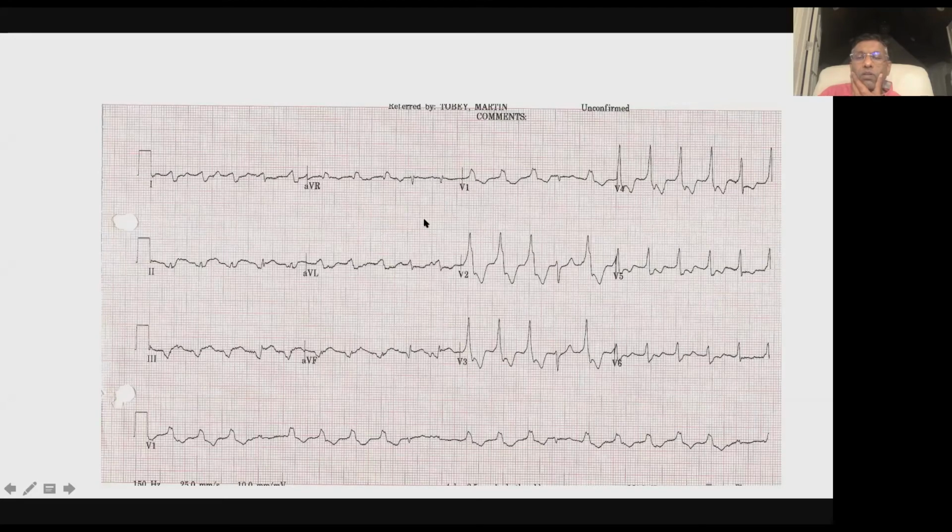Typical. Yeah, hard to tell. I'm having difficulty telling because I can't really tell if one's taller than the other. They're almost the same height. Maybe a little unusual. Maybe the initial R is actually taller than the R prime. So can't tell for sure.